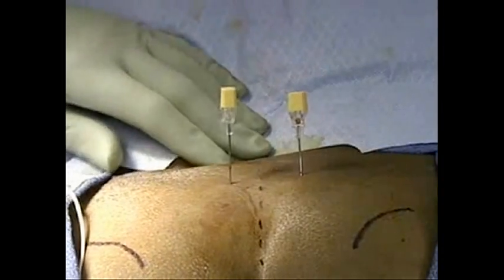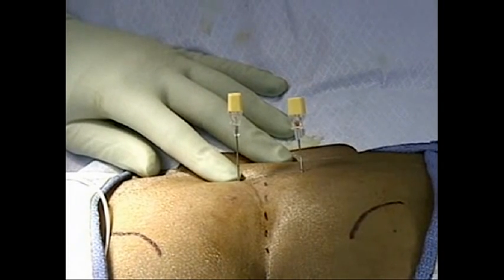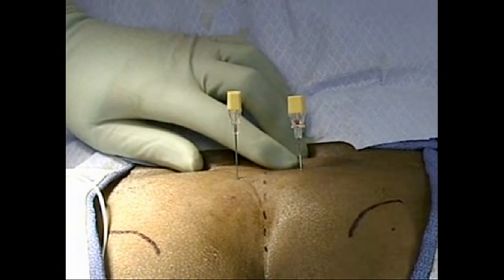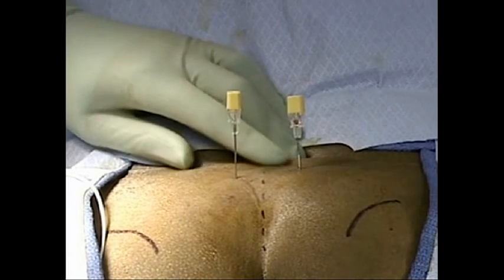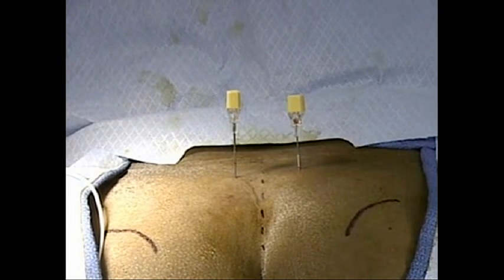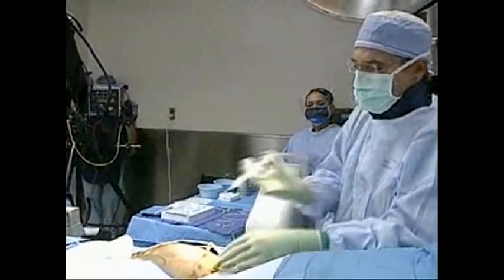At this point I really have two choices: I can go ahead and place simply the left wire into that S3 foramen, I can introduce a wire into the right, or I can see whether or not I can also get a response into the S4 on that side. Because in truth, we can get benefit not just with the S3 foramen but also with the S4 foramen.